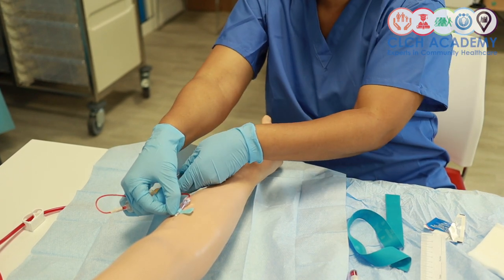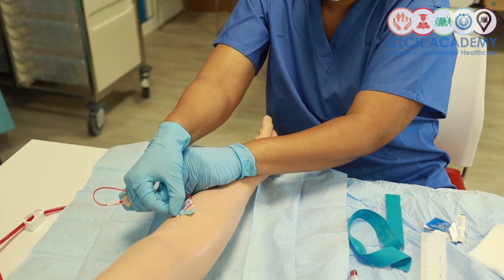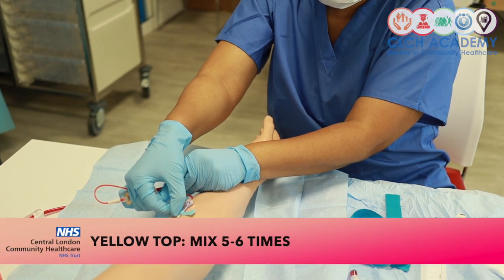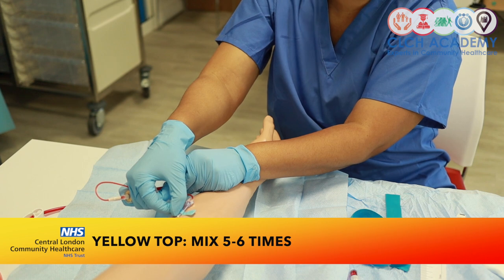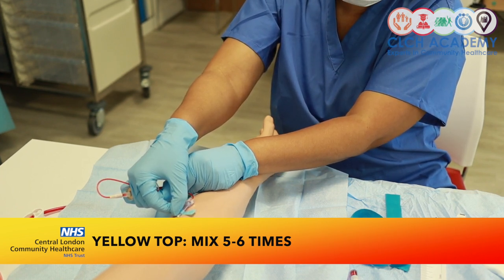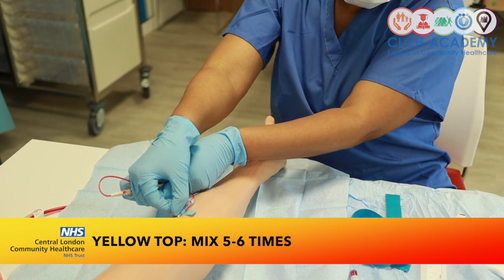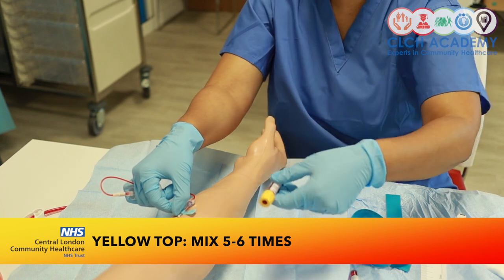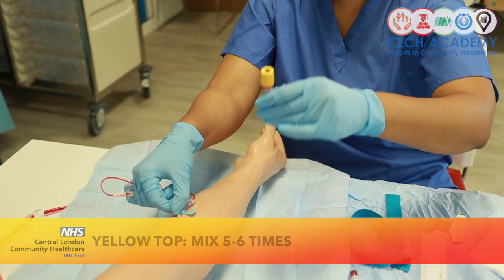My yellow bottle for that. Collecting my sample. Again, I'm aiming to fill this to the recommended level. However, for this bottle, it's about 3.5 mils, which is acceptable. And I now have that in my bottle. I'm going to do my inversions. 5 for the gold bottle.